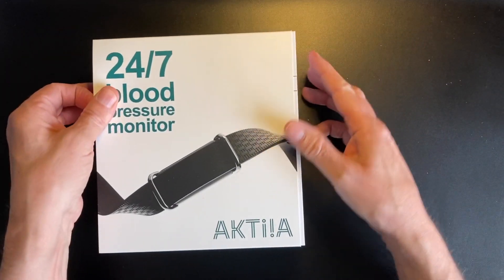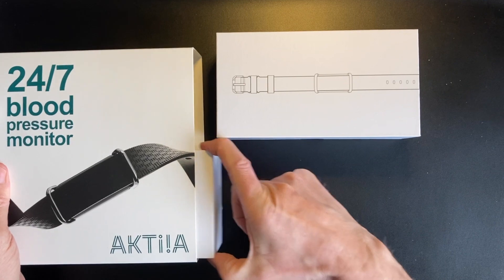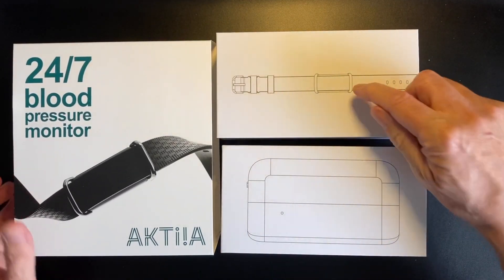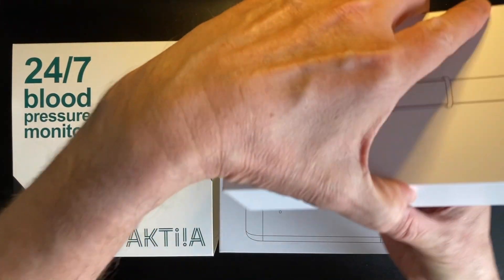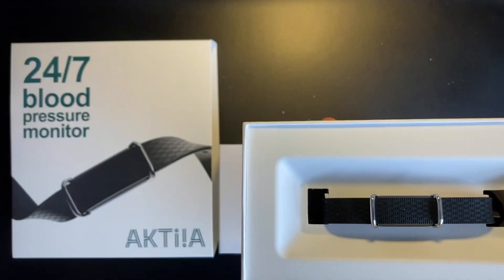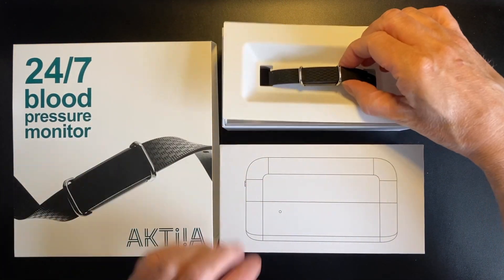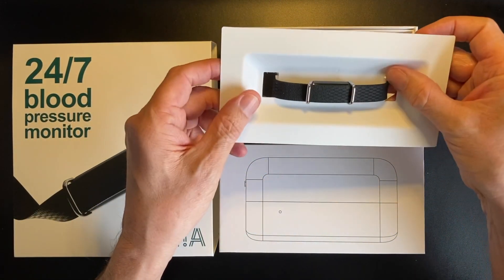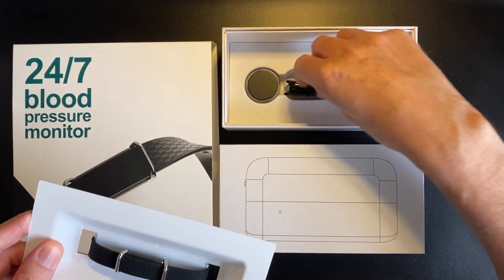I'm going to show you what's in the box. We actually have two boxes — one which is the actual wearable, and one which is a blood pressure cuff. Inside one box is the core device, the main device that does the blood pressure measurement, and within there we have the charge cable and the cradle.